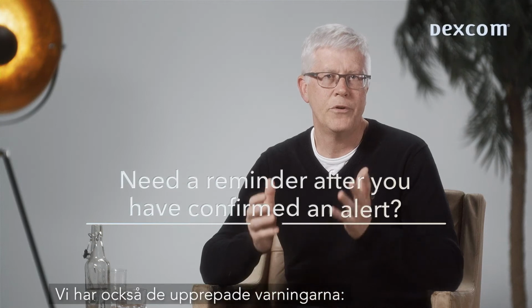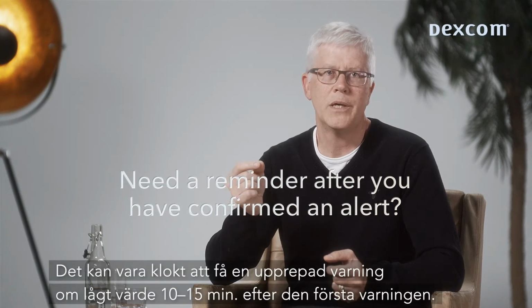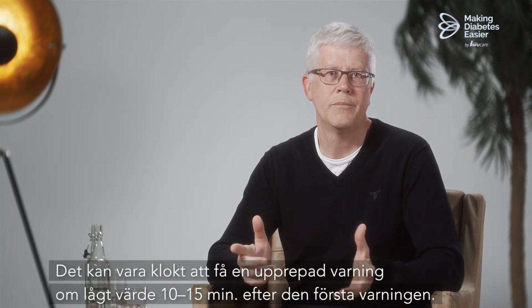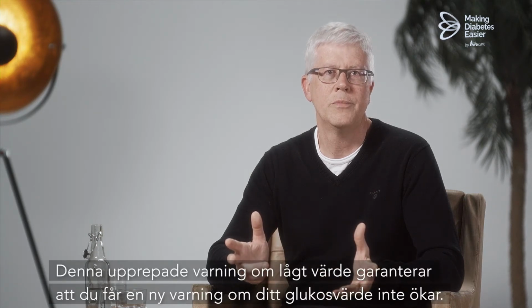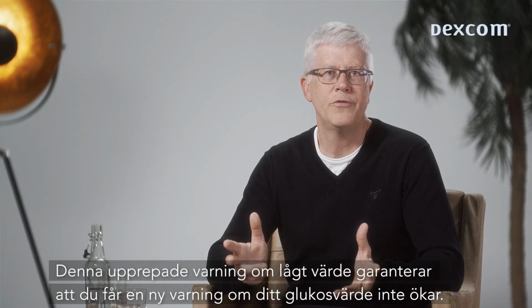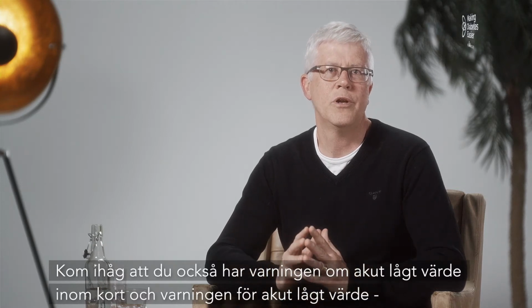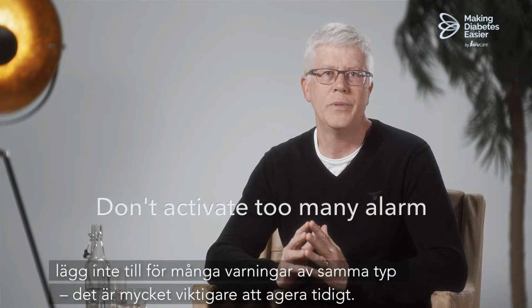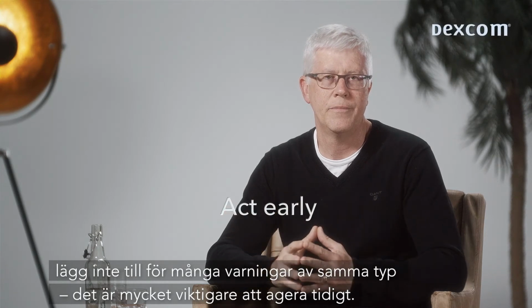We also have the repeated alerts. A repeated low alert might be wise to get 10 or 15 minutes after the first one. The repeated low alert will ensure that you receive a new alert if your glucose value doesn't increase. Remember that you also have the urgent low soon alert and the urgent low alarm, so don't add too many of the same. It's far more critical to act early.